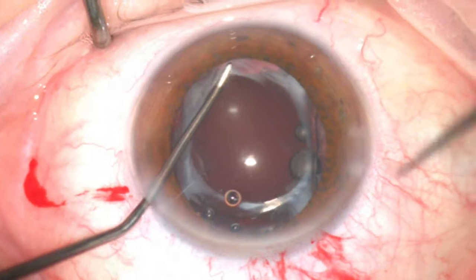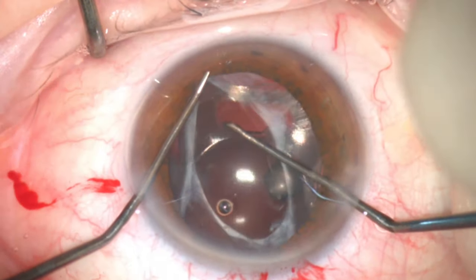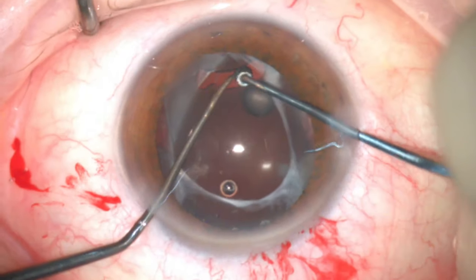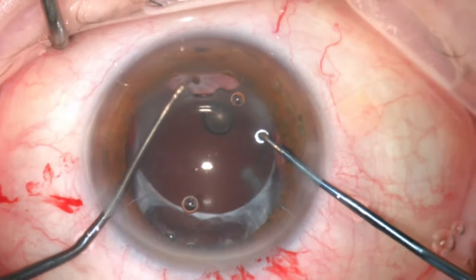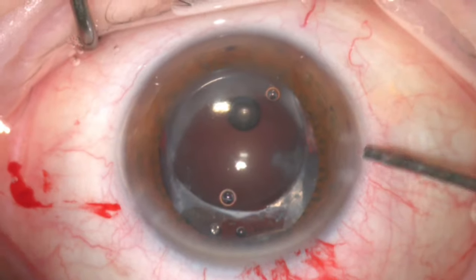Then I started the lens explantation. A second instrument, such as a Y-lens pusher, was used to support the capsular bag while using a Sinski hook to explant the haptic of the lens. The same process was repeated from the other side port to explant the other part of the plate haptic from the capsular bag. This counter-traction helps to minimise any stress on the zonules.